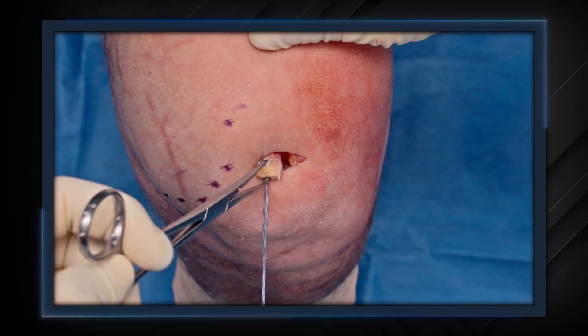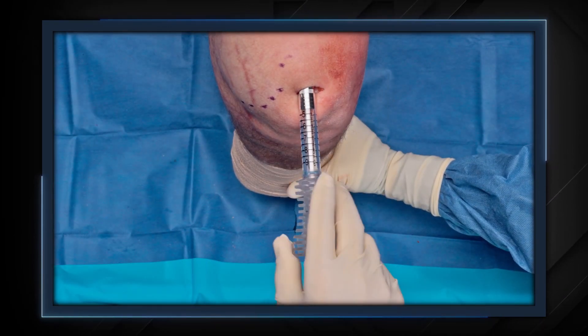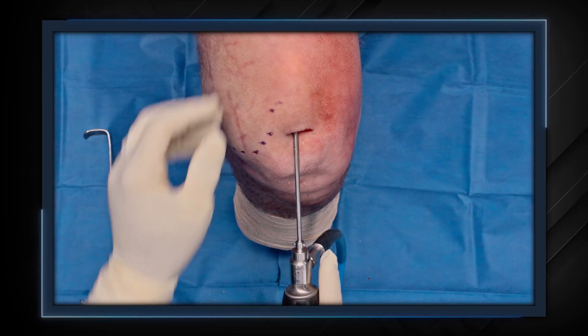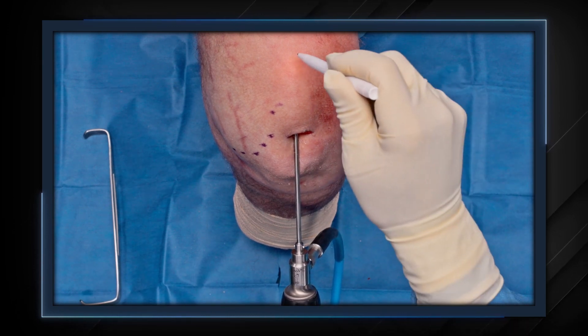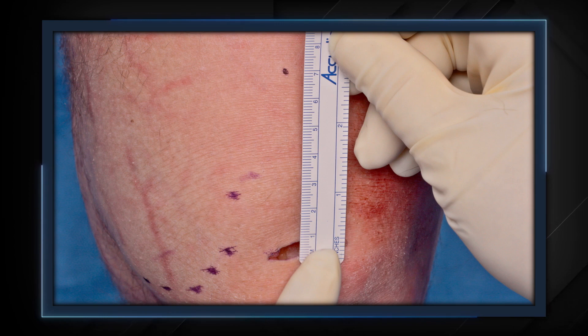That's what the quad pro is for — it makes it easy. You put it on and just move it 360 degrees. Let it find its path. It measures perfectly and you're going to get a beautiful tendon. And Lee, what about you? I think early on a big concern for a lot of people is directionality. They're afraid that they may skive off and go one way or the other. So to John's point, get a retractor in there, put a camera up, see the quad tendon, see the musculotendinous junction. You can actually lift the camera up and sort of indent the skin. You can put a little purple mark there, and that way when you're using the quad pro, you can aim towards your purple mark. You're not worried about skiving off into the muscle.